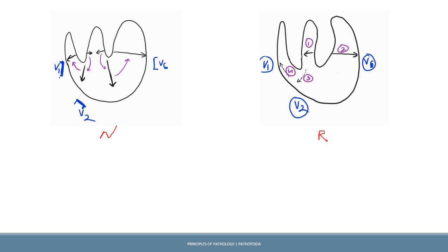So we are going to again plot the ECG findings with the help of the vector. What is bundle branch block? In the right bundle branch block, there is delayed depolarization of the right ventricle, because of some block in the right bundle branch. So the left septal wall obviously depolarizes first, and that is then followed by the left free wall depolarization, and then the delayed right ventricle paraseptal region, this one, and this would be the free wall.